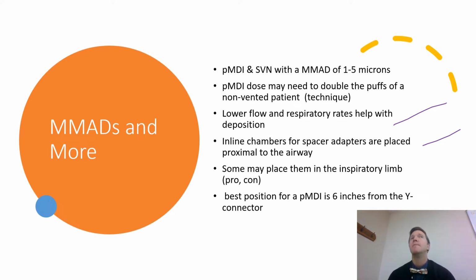But with the inspiratory limb, if you're leaving it in place and it expands during delivery and then collapses, you may not need to do a short self-test. However, I recommend that whenever you're adding anything before the Y, whether it's on the inspiratory limb or expiratory limb, you do a short self-test. That's where you re-SST the ventilator, so have someone bag the patient.